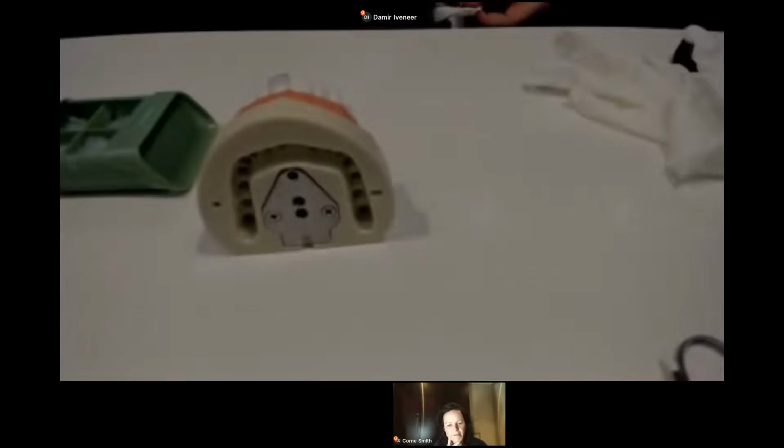Okay, let me see. Oh, there's a very relevant question here. Is this a single-use product? Yes, it is. It is a single-use product.